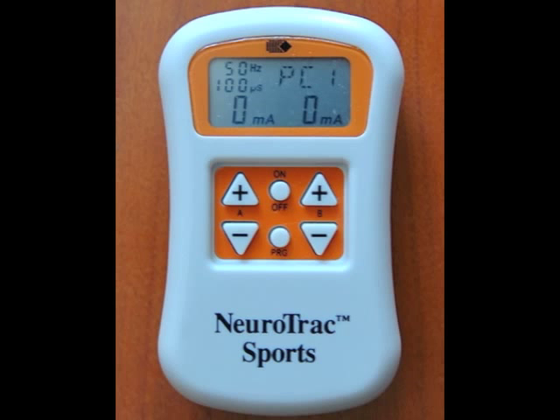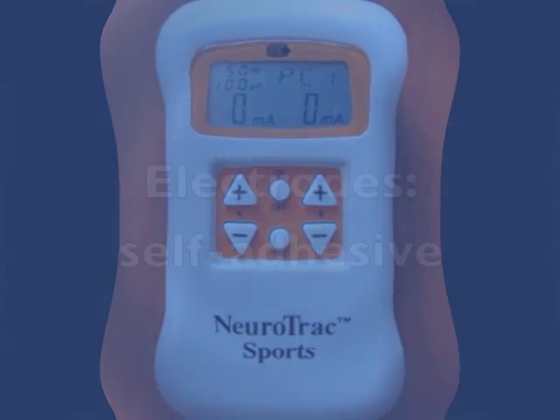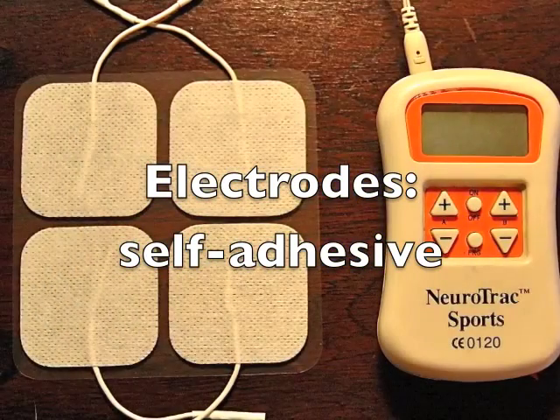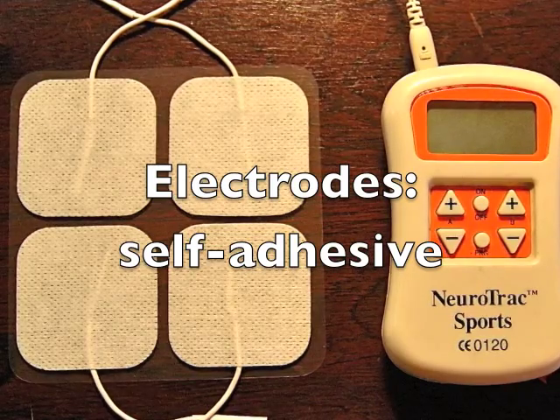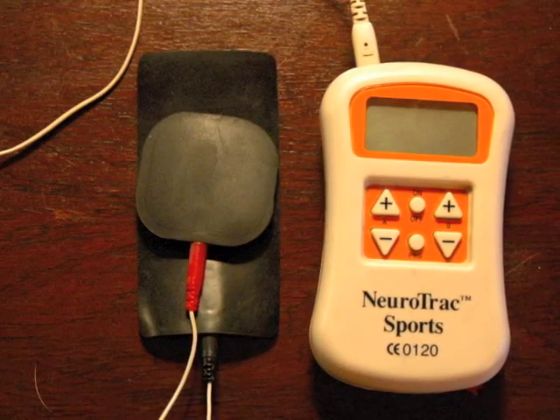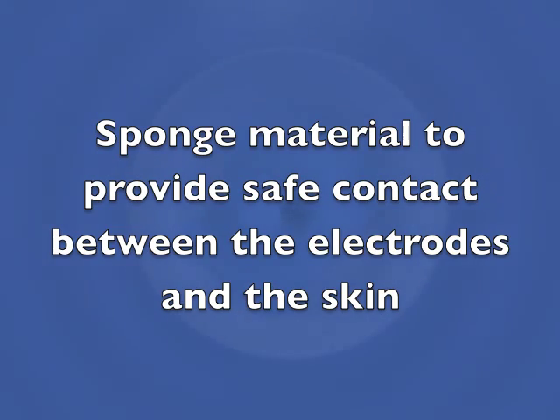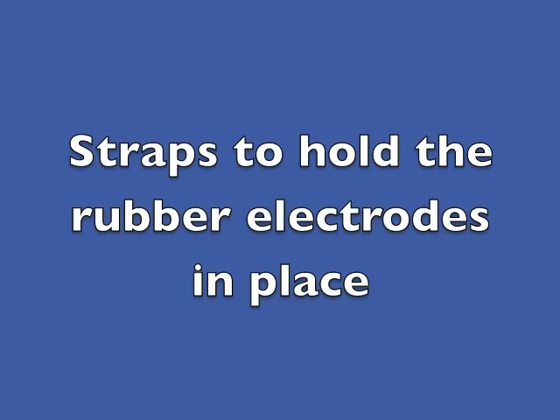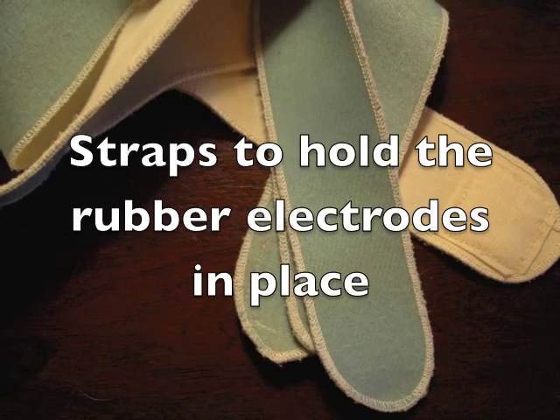The Neurotrac is now ready to be used for rehabilitation exercise. To carry out the treatments you need electrodes. This machine comes supplied with self-adhesive electrodes and gel for contact. I normally use rubber electrodes which last longer, and then you need sponge material which is dampened to provide contact between the electrodes and the skin, and straps to keep the electrodes in contact with the skin. And now everything is set for action. Thank you.